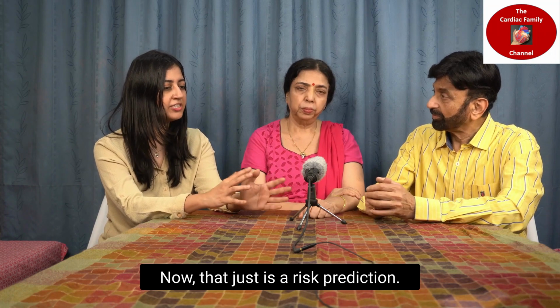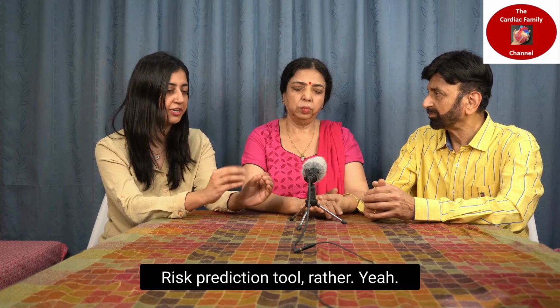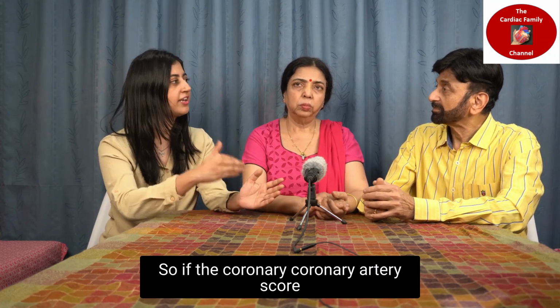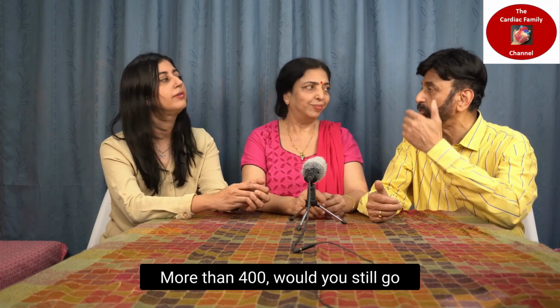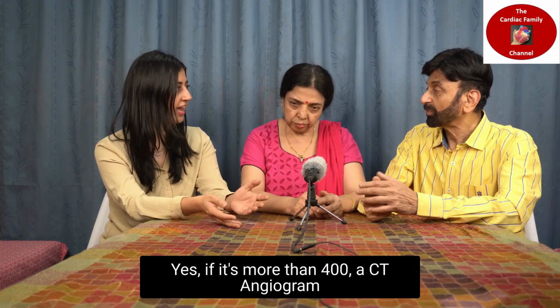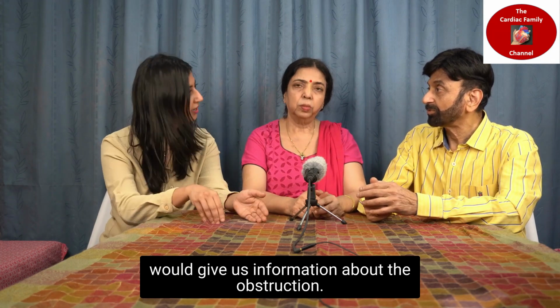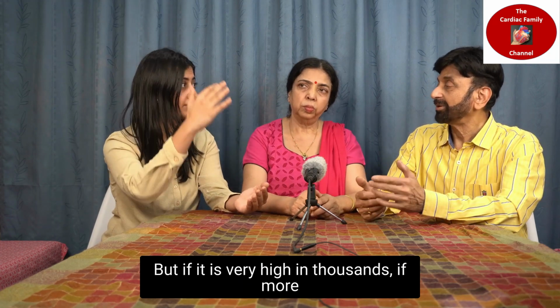Now, that is just a risk prediction tool. So if the coronary artery score is more, more than 400, would you still go ahead and do a CT angiogram? Yes, if it's more than 400, a CT angiogram would give us information about the obstruction. But if it is very high, in the thousands, more than 1,000, you will not do a CT.